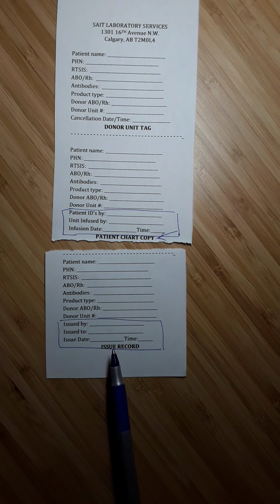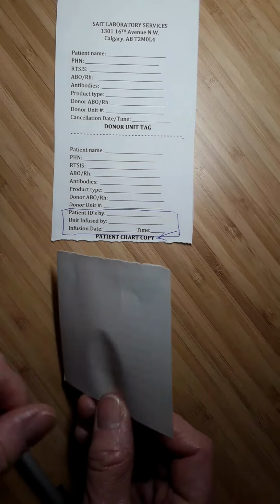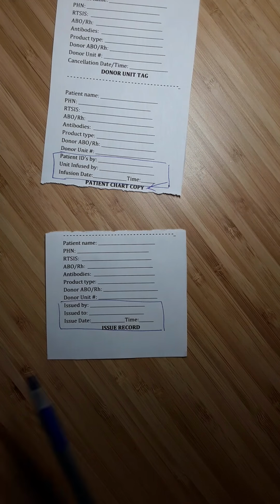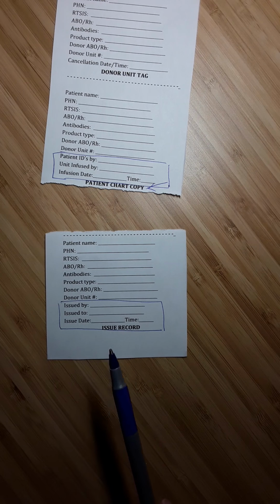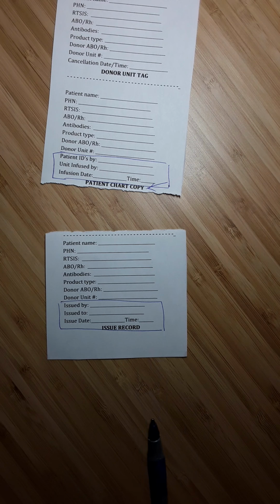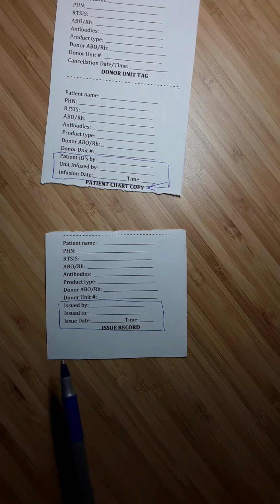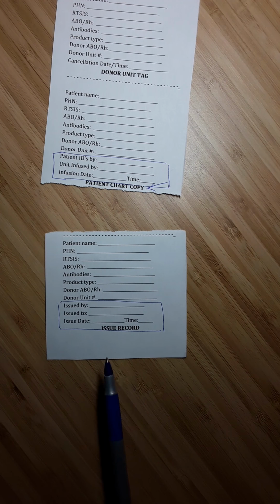So my portion of the tag that I took off when I issued the blood to the person that came to pick it up, that will get put on the back of the type and screen rack. So you'll turn it over and peel off the backing, and it'll be sticky, and then this will get attached to the back of your type and screen rack. So that'll be a nice record of the units that have been issued to that patient. So let's say you have a downtime and you aren't able to access your records in Millennium, and you're wondering how many units of blood a particular patient has had. You can look at the type and screen requisition, turn it over, and then see a record of what indeed they have been issued.